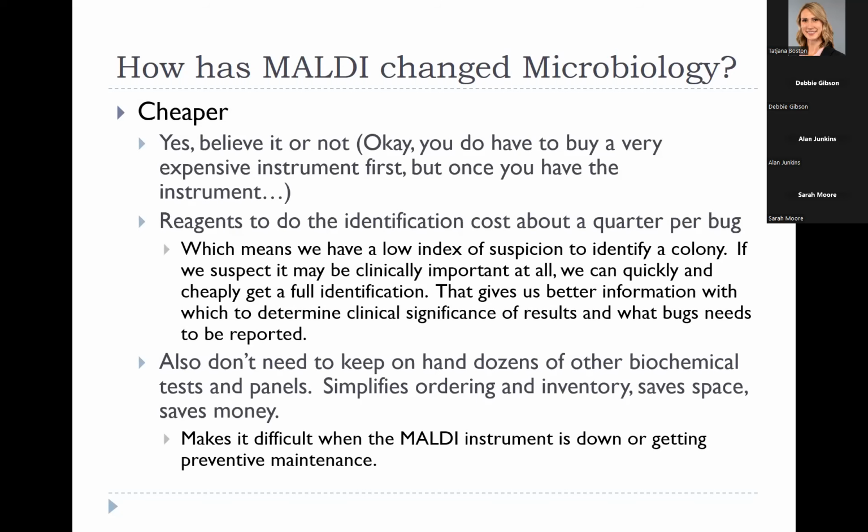I'll tell you, the 2 facilities in the state of Kentucky that got MALDI first, we were not one of them. We were number 3. The first one is actually a very small laboratory that was able to get it, presumably because the CEO thought it was cool. The other one was a large laboratory, and I talked to their laboratory director, and she said she went into administration and said, reduce length of stay, and they wrote her a check. It didn't work here. I said, reduce length of stay, and they said, yeah, okay.